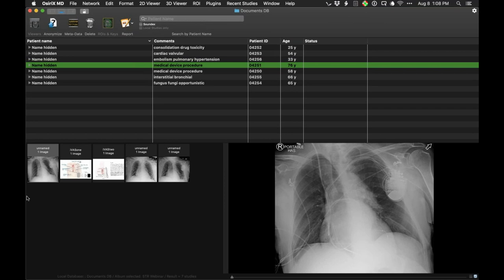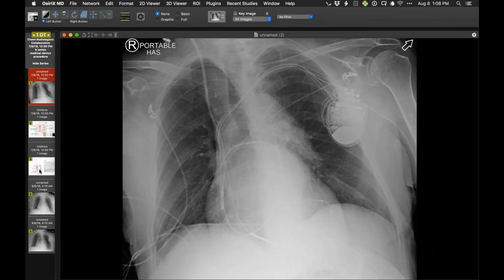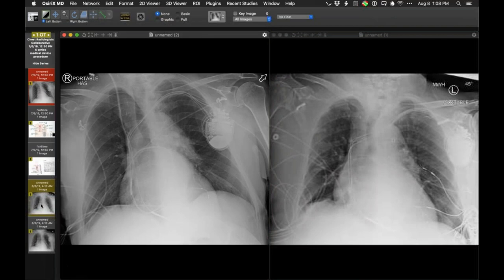Good, okay. So let me start with a couple of devices. I'll put up two radiographs, and you'll tell from the one on the left-hand side that new items are present compared to the prior. And you can see on the prior image that the patient has a CRTD device, which of course is intended to improve ejection fraction. But on the right-hand side, we have in addition to that something else new. So I'll bring that up.